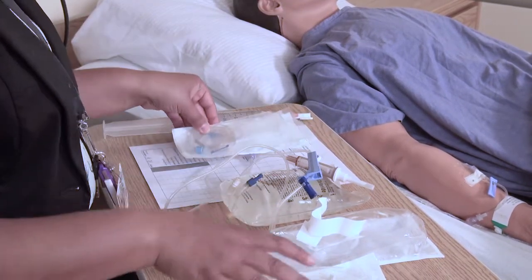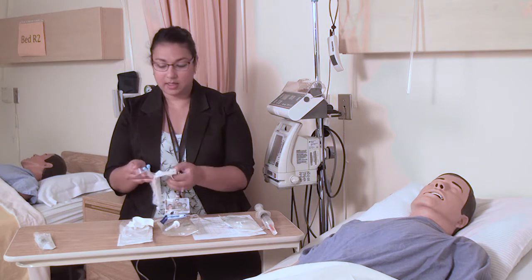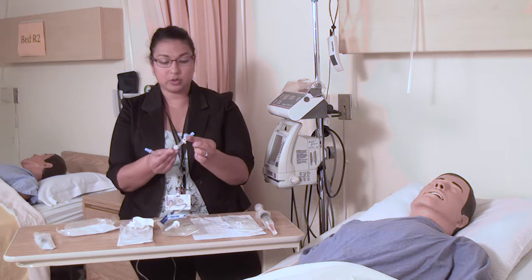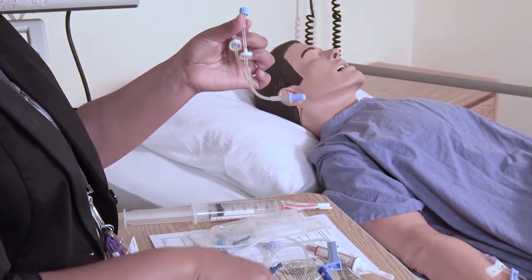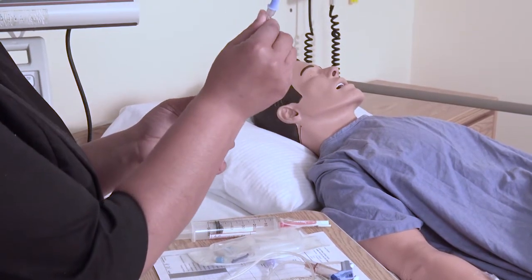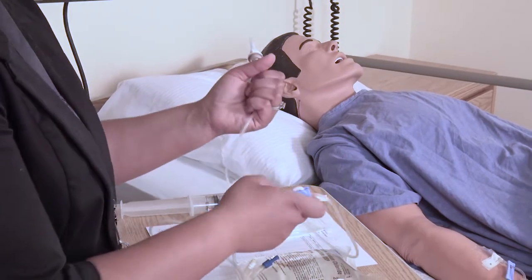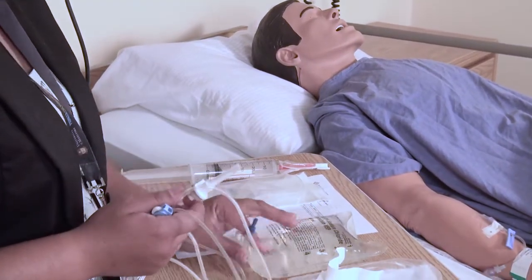Aside from all this, you also need a Y extension set, and it looks like this. This is where you're going to attach your PCA tubing once it's primed. Then you're going to attach your solution carrier set into this side. And this is what's going to go into the patient. So I'm going to prime all this up, and then we can attach it to our patient and program the pump.